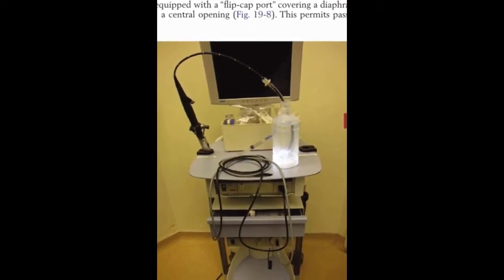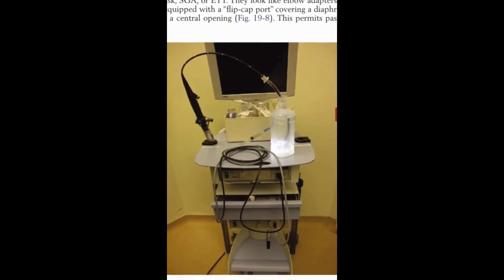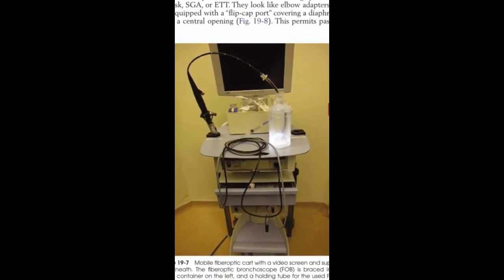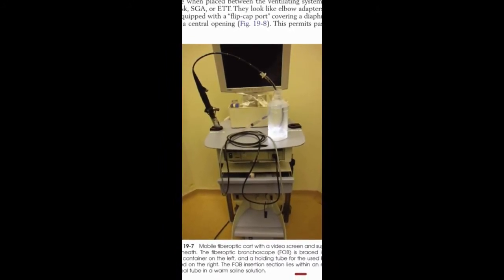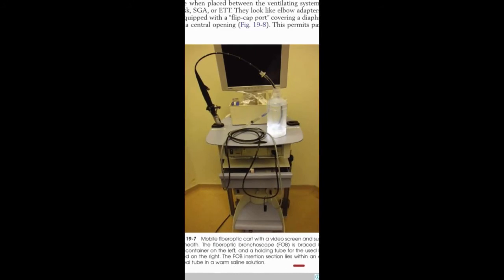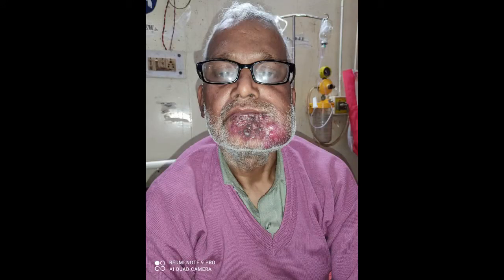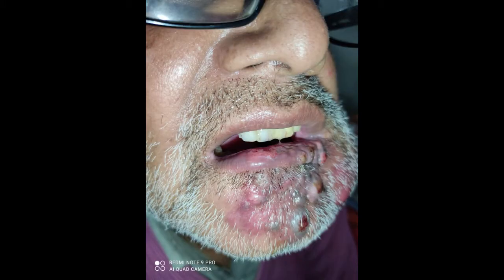The difficult airway cart should also contain local anesthetics, a video laryngoscope and screen, supraglottic airway devices, ET tubes, introducer and exchanger, and percutaneous airway rescue equipment. The case presented is a 54-year-old male patient, a case of carcinoma of the mandible, who was planned for wide local excision with bilateral modified radical neck dissection with free fibular flap repair.